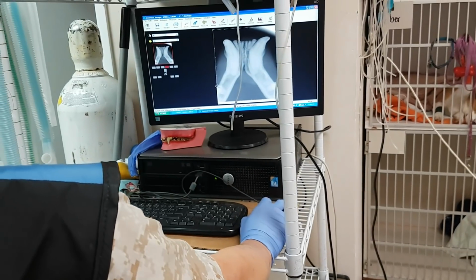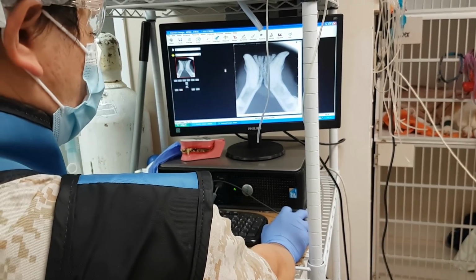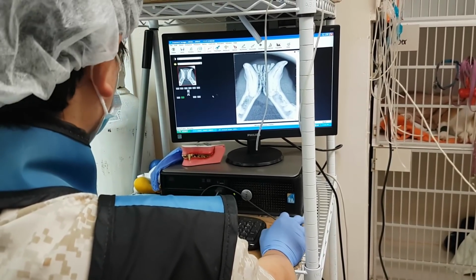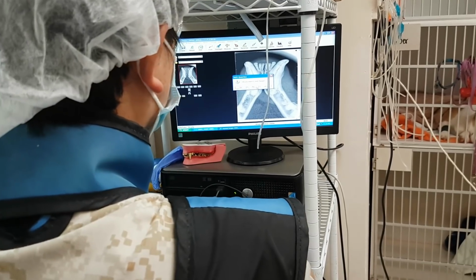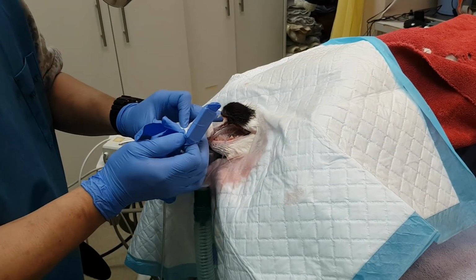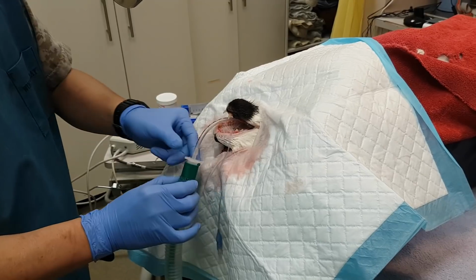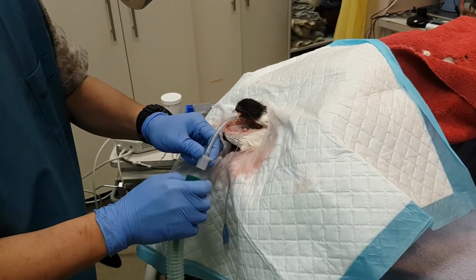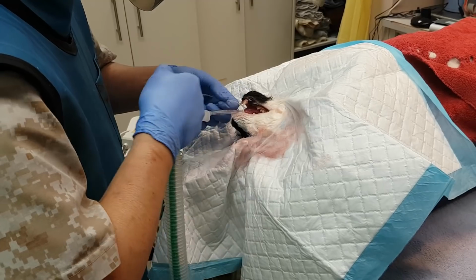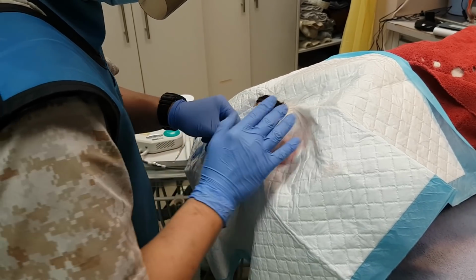There's our first glimpse of Lancelot's jaw with a radiograph. Looking pretty good. You can see the little mouth model in the foreground to remind us of how many teeth our patients are meant to have, because of course it varies by species. And of course, radiographing every section of the mouth requires a slightly different position and slightly different technique. You can see Mr. NJ is adjusting the endotracheal tube when he moves the patient around to avoid having it kink inside of Lancelot's mouth and interfere with gas transfer. I think this really illustrates what a technical skill it is to do dental radiographs.